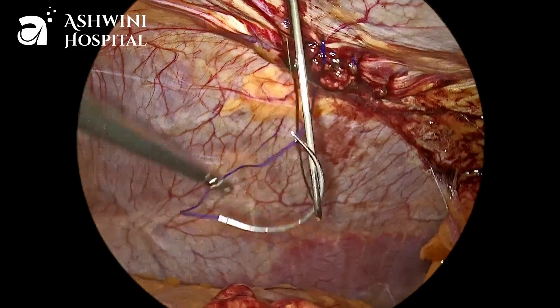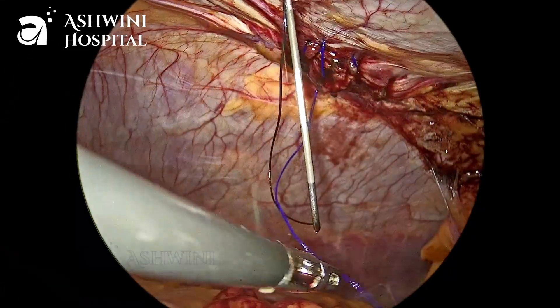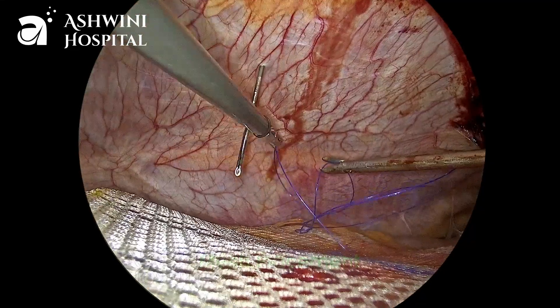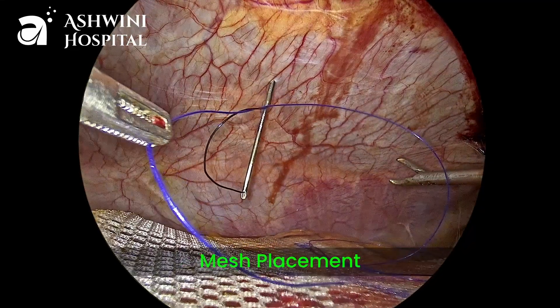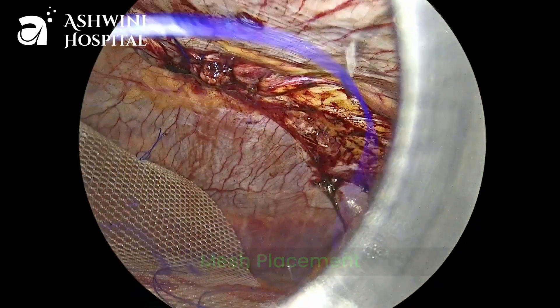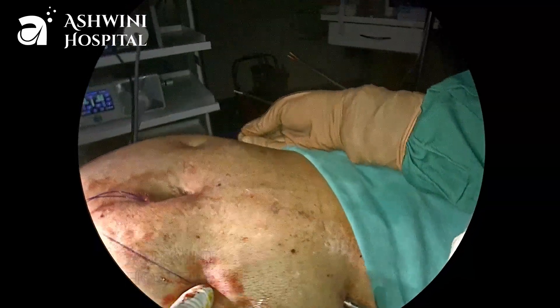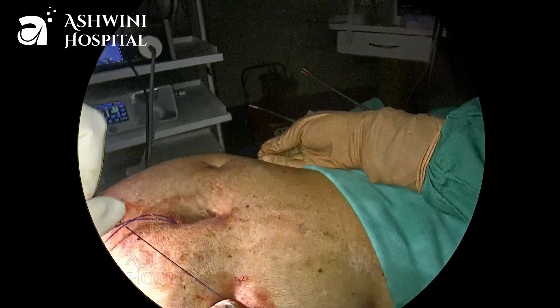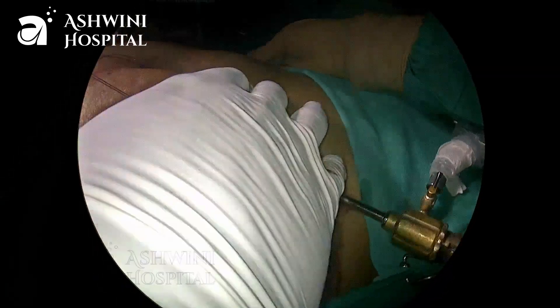The suture is brought outside and the knot tied in the subcutaneous area. Now we have a 12 x 12 cm dual layer round mesh placed inside the abdomen, fixed by using trans-fascial sutures on both the right side and left side. You can observe how we tie the trans-fascial sutures outside — the knot sits in the subcutaneous plane.